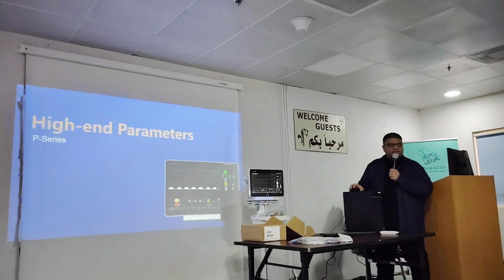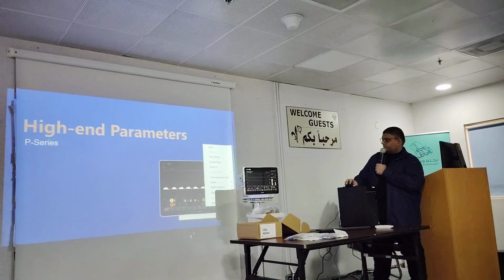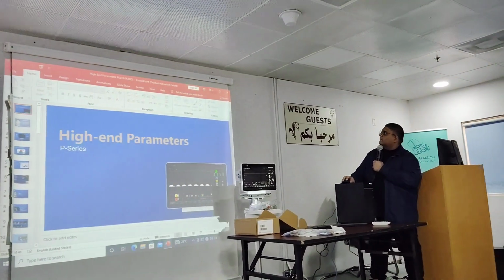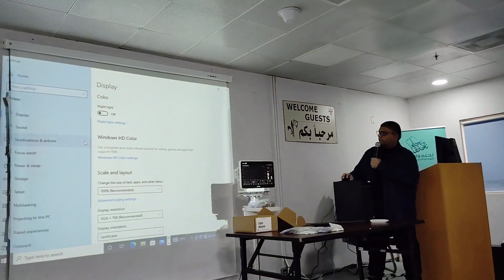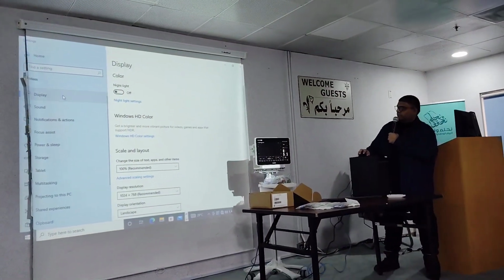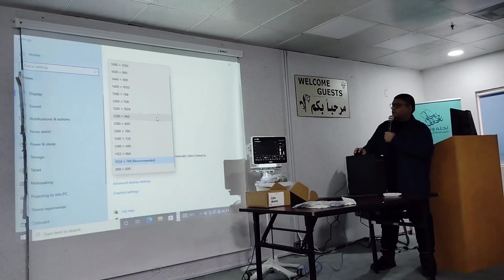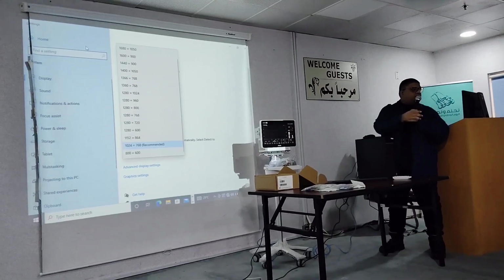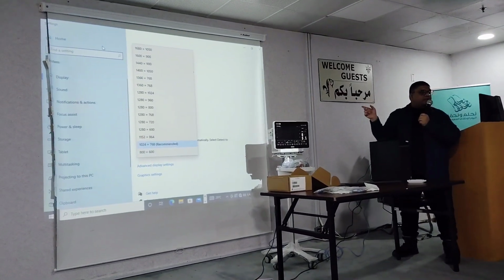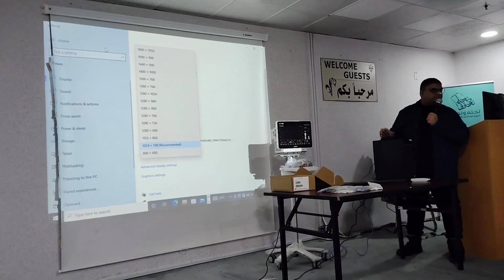There's a standard for the central monitor. Just check that one. There is a standard. Because if you are using below 1024 by the maximum... Okay. So, in their department, go and increase the resolution and see if it resolves the issue. It should resolve it.